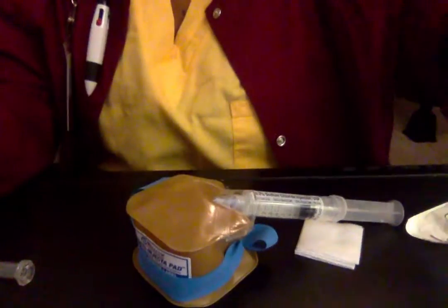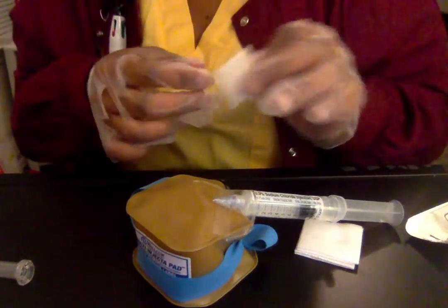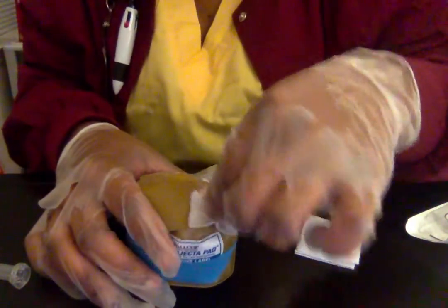When I'm discontinuing an IV, you really only need a couple of things: your alcohol swab, some gauze, and some tape. Today we're working on the same IV, so I've got my alcohol swab, and with this I'm going to go around the skin, and it'll loosen up that tape a little bit.